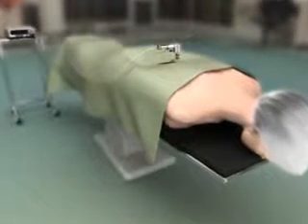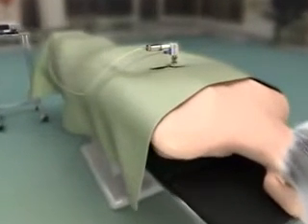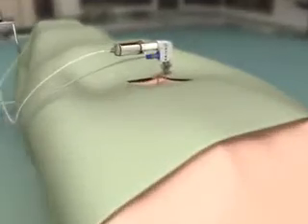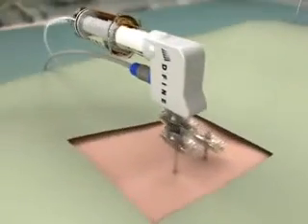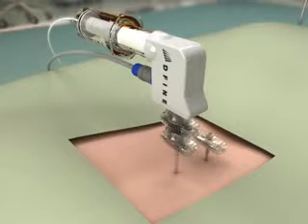The introducer, which is comprised of a working cannula and stylet, and is part of the Stability Vertebral Augmentation System, provides access to the vertebral body and facilitates delivery of the ultra-high viscosity Stability energy-responsive bone cement.